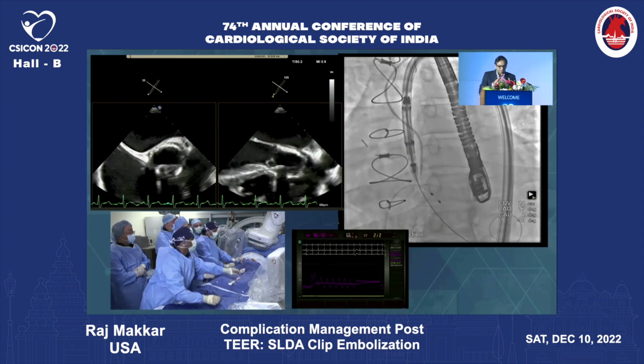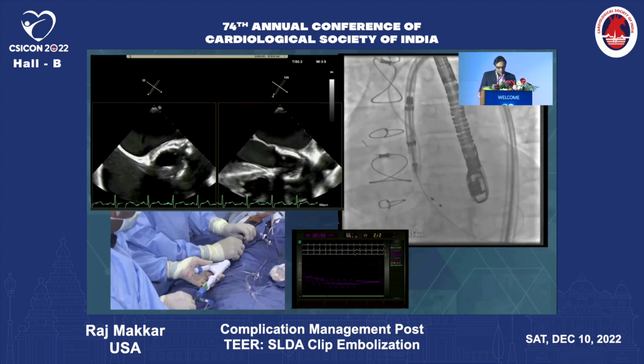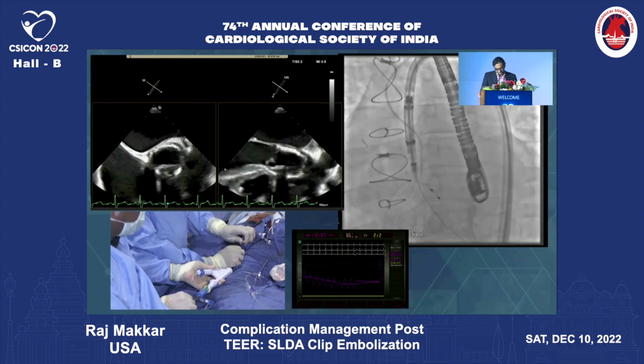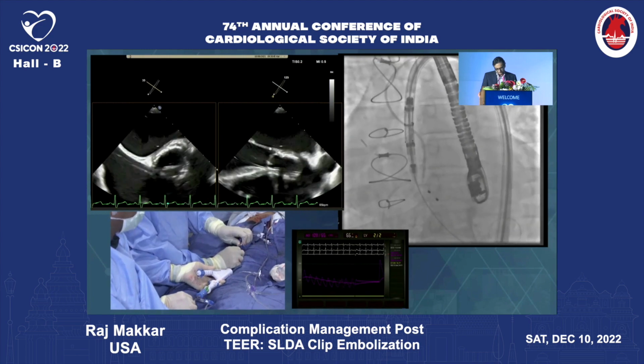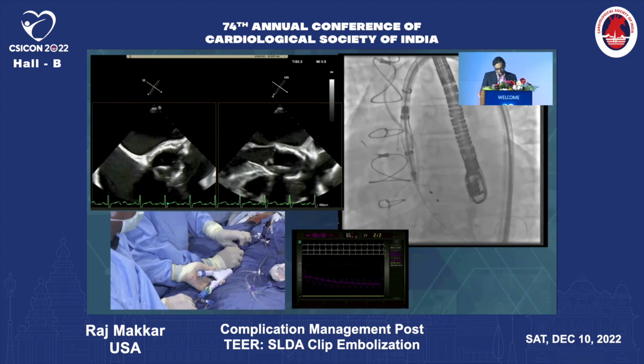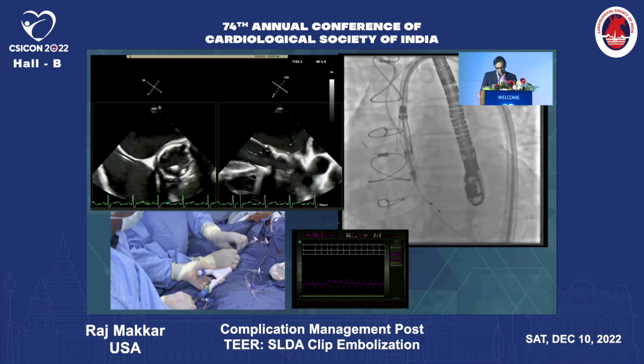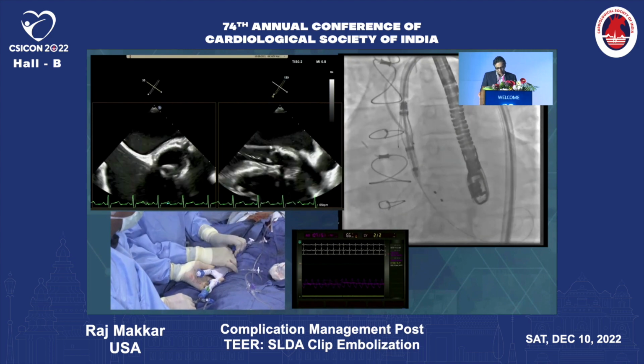All right, so the concept is you're delivering the valve through the sheath, because it has these locators. Are we absolutely sure? So we are going to go ahead and withdraw the sheath. And you plan to take this all the way back into the descending, correct? That is correct.